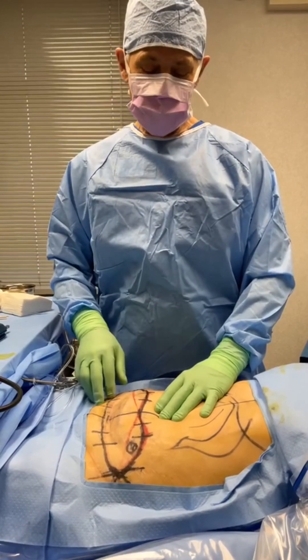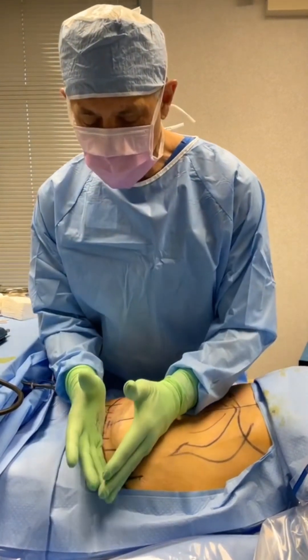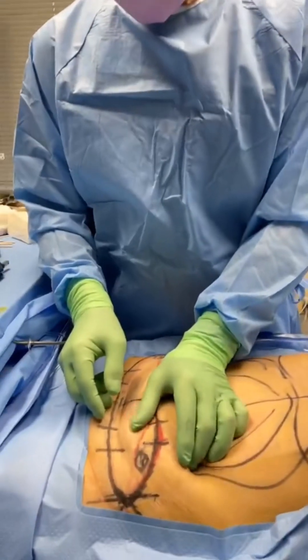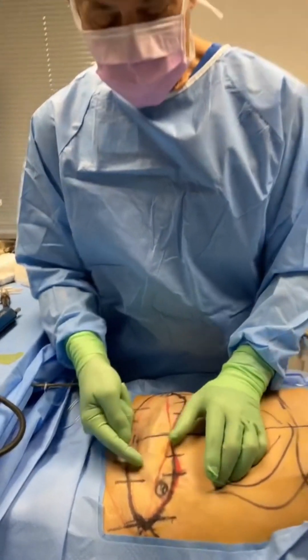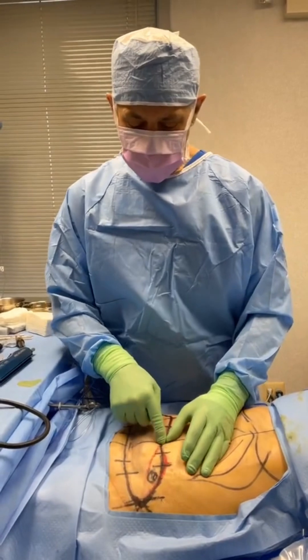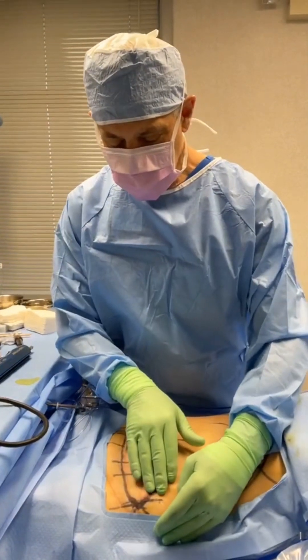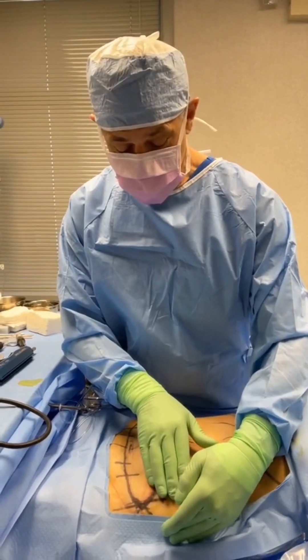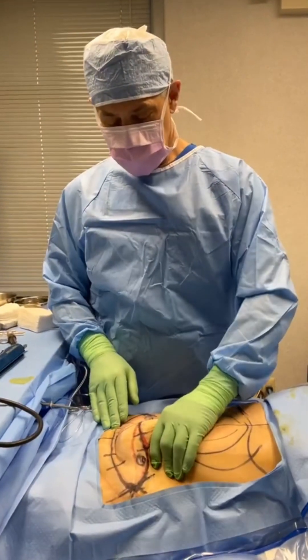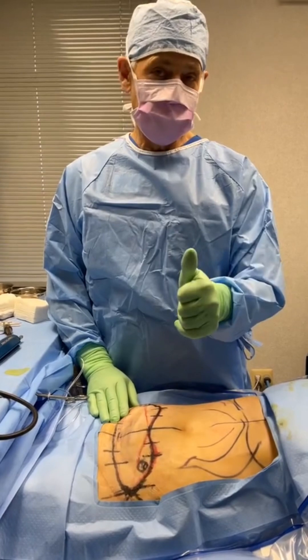Or sometimes we can do what we're going to do today, which is HTLA — high-tension lateral advancement. Instead of just taking off this little ellipse of skin here, I've made the wings on the sides a little higher. I'm going to take those out so that when I put this back together, this is going to go down there — so it's high, and it's going to be under tension. For lateral advancement: if you measure this distance here, it's actually longer than this distance here, so I have to pleat this a little as I put it on. As I'm doing that, I'm advancing this upper edge of the tummy tuck incision towards the center, which has the effect of bringing in the waist for a more contoured shape. So: high-tension lateral advancement, extended mini lipo abdominoplasty with VASER and Renuvion.